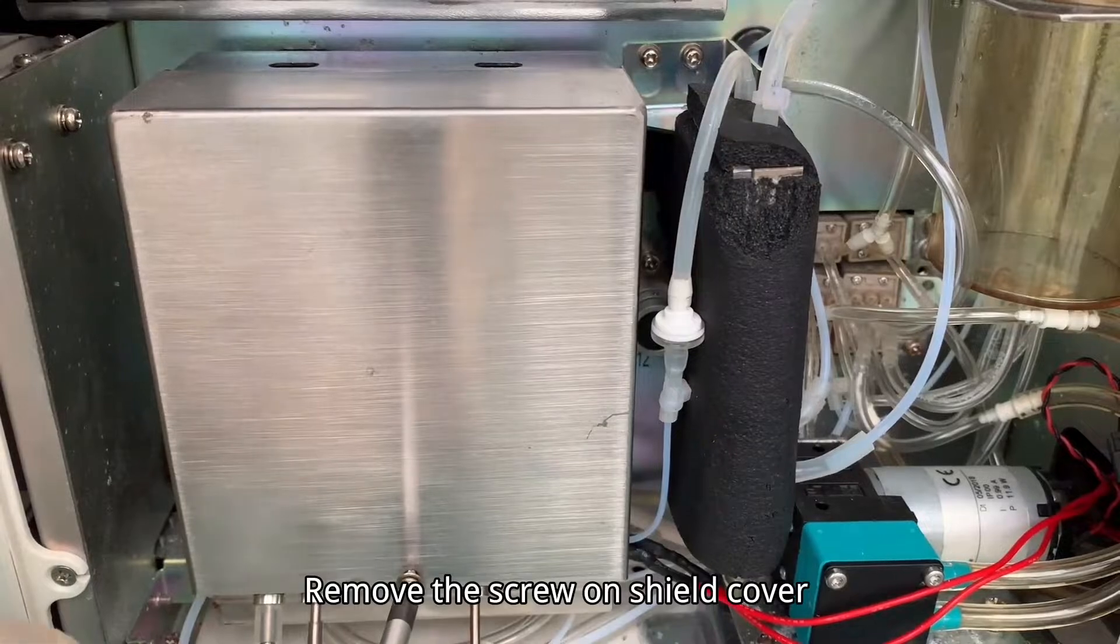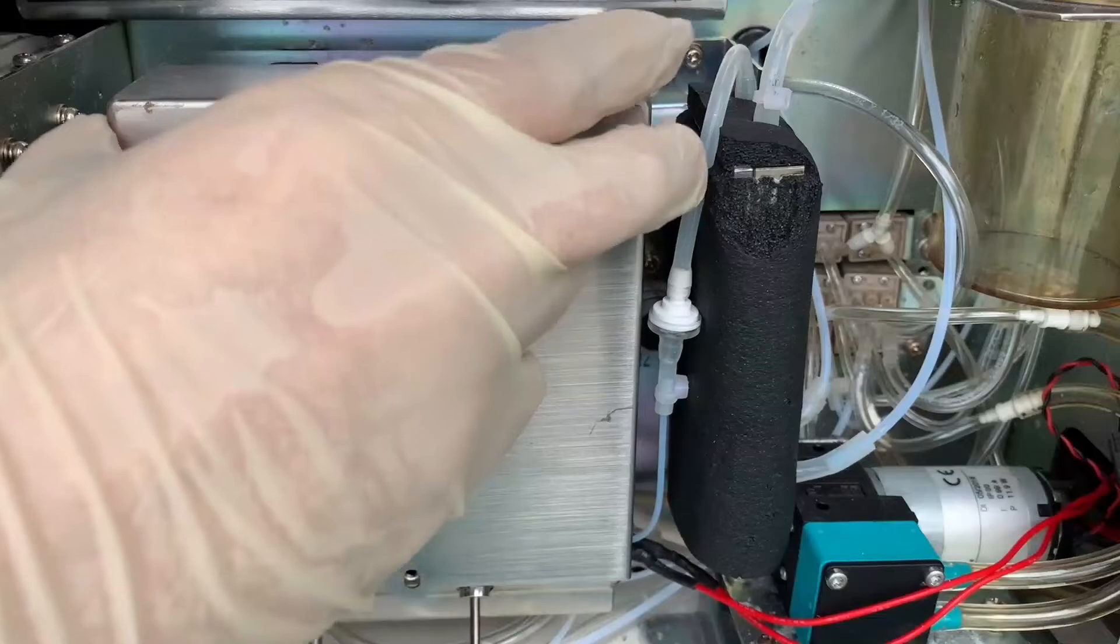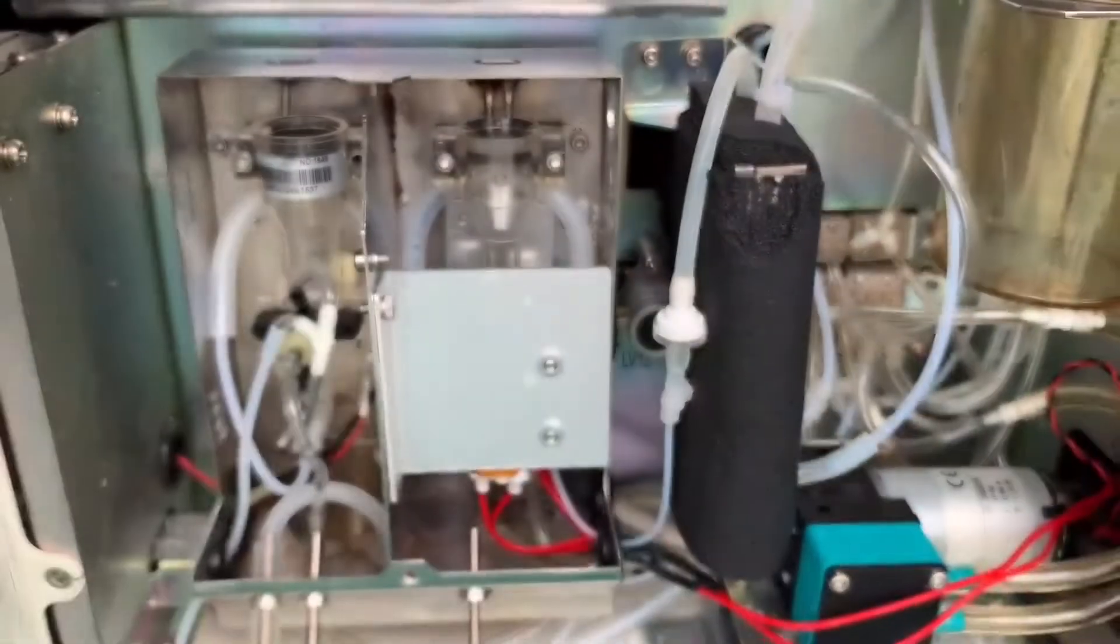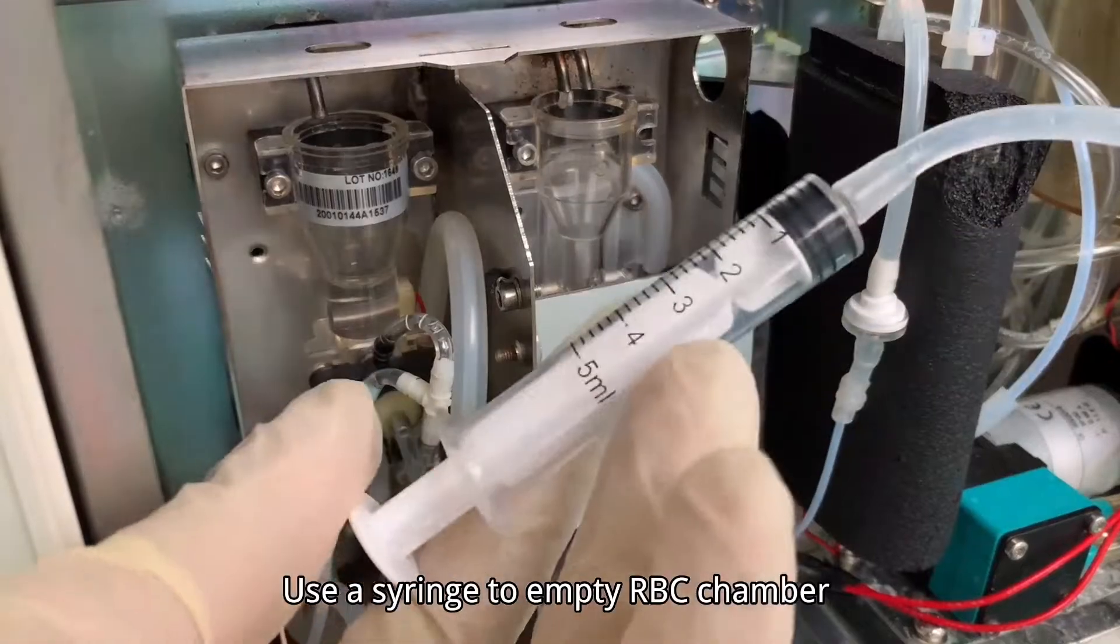Remove the screw-on shield cover. Use a syringe to empty the RBC chamber.